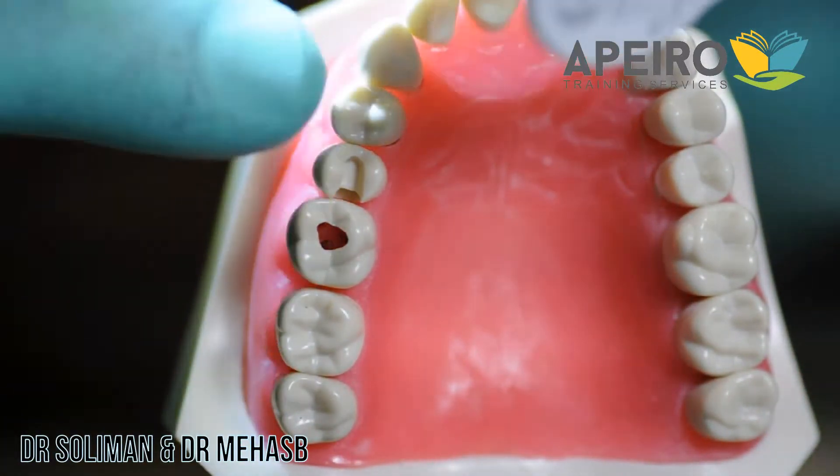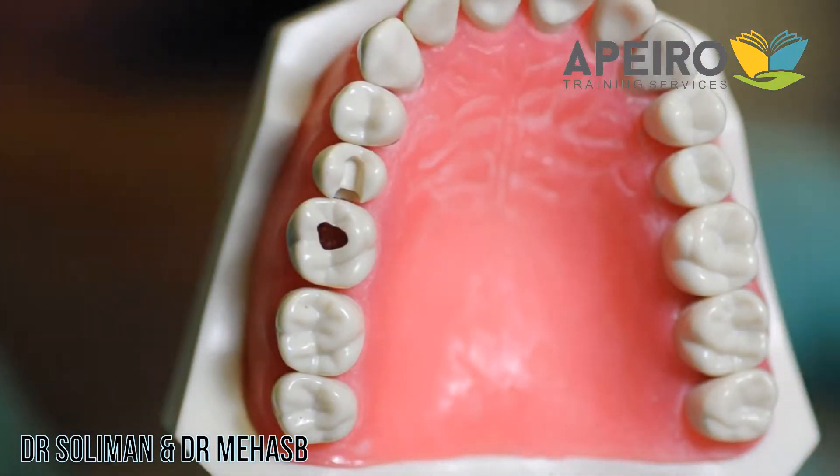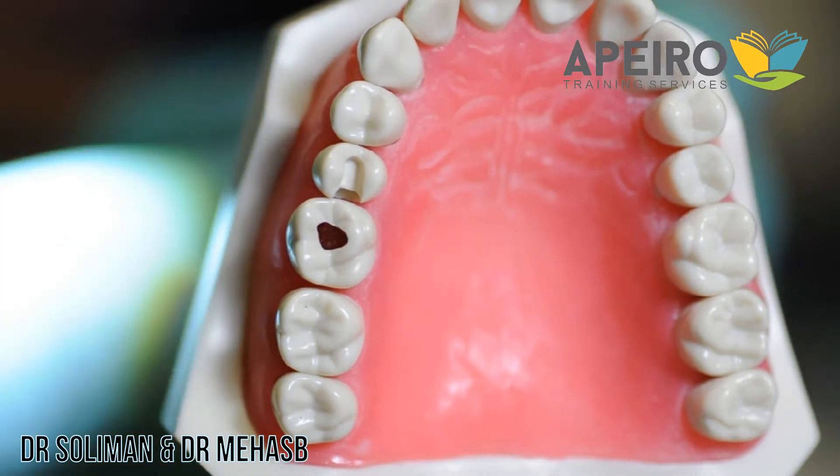The tooth we are doing today is the 1.5 DO cavity for a Composite Class 2 restoration.